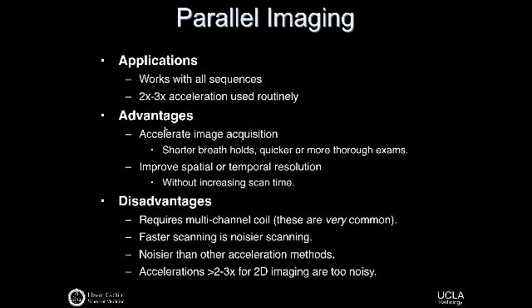What are the advantages of parallel imaging? Well, it's accelerating the image acquisition, so we get these shorter, more thorough exams. I think I said that. We may use it to improve spatial or temporal resolution, so for a fixed amount of scan time, I can take a 10-minute protocol, add parallel imaging, and maybe get better spatial resolution. And that might be critical for certain applications that require higher spatial resolution.